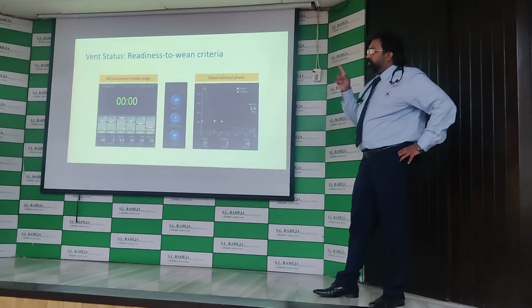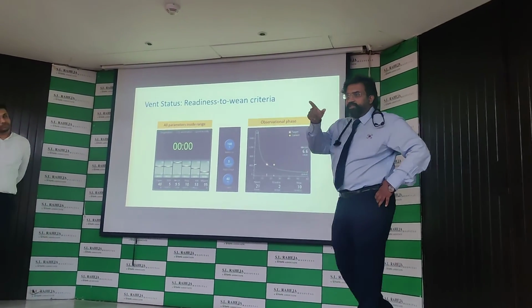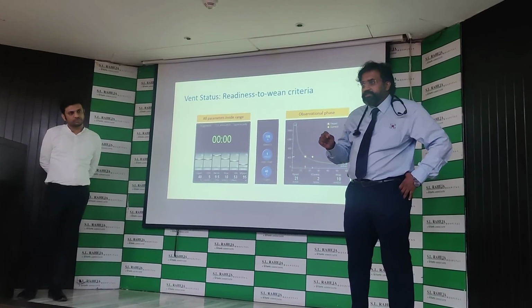Now, how do you adjust it if the patient is in distress? So if you have a patient, like the other day you were telling me that the RR went up and the patient became distressed, what should you have done?